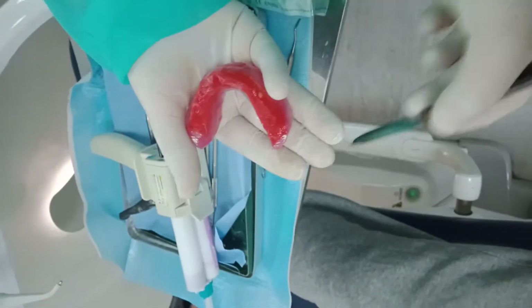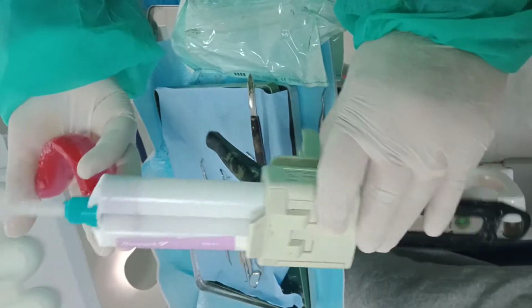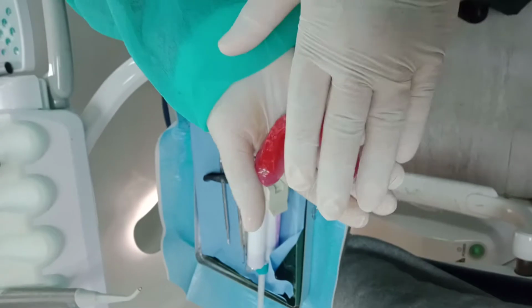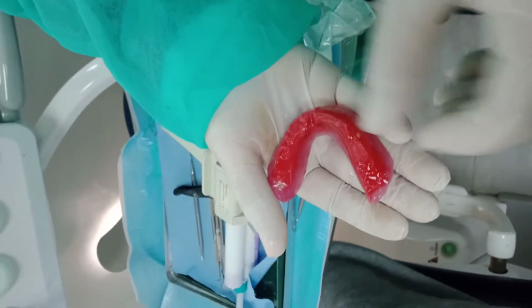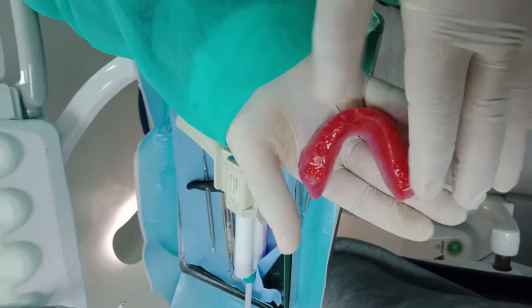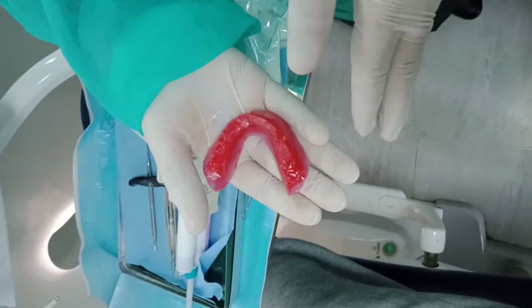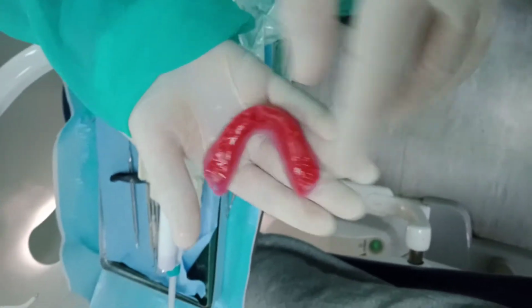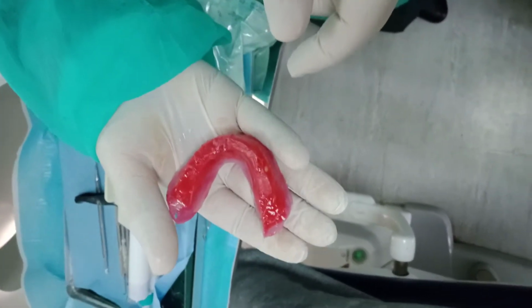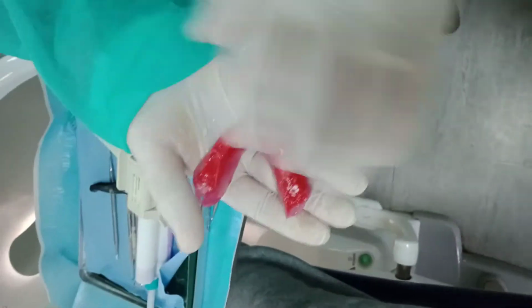Okay. My second step, for the rubber not to come out when I take the occlusal bite, because this is the occlusal, it's a type of rubber, and rubber does not adhere to wax. So you're going to dry this, wash it very well, dry it maybe with alcohol if you like, or soap, so no mucin is there, no remnants of saliva is there, and then apply rubber adhesive. Do you know the adhesive that we use for trays in rubber impressions? The same adhesive. So apply over the wax, paint on the rubber adhesive. Okay, allow it to dry very well until it's very tacky, and then take the occlusal bite.